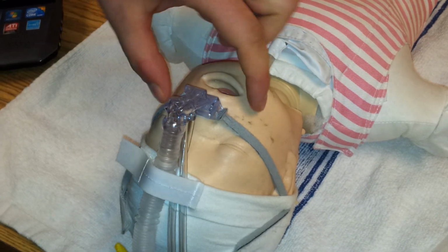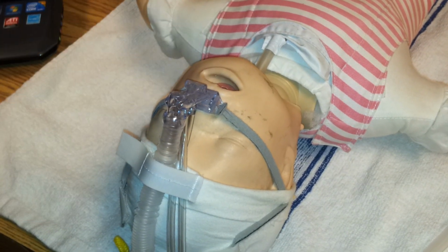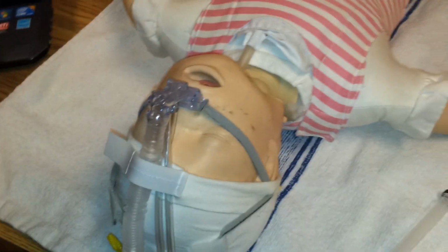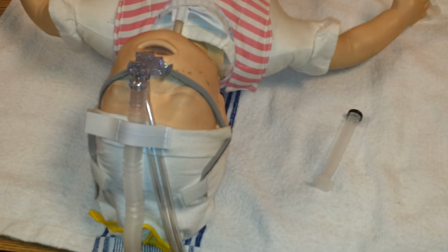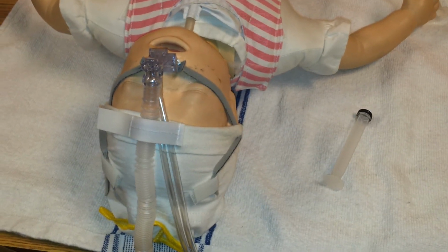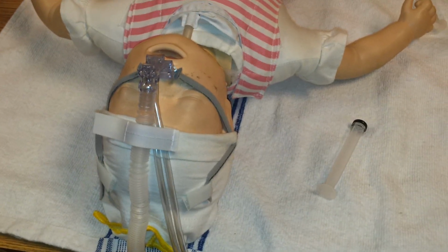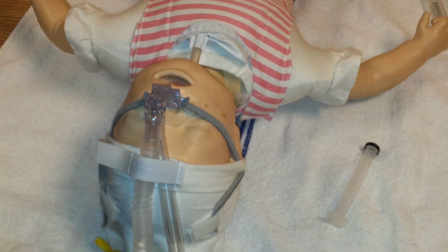And babies are nose breathers, so they're going to get distressed very easily if the prongs are blocked. So you check that. It can also be caused by pneumothorax, cardiac tamponade, or hypovolemia, but the biggest one is blocked prongs.